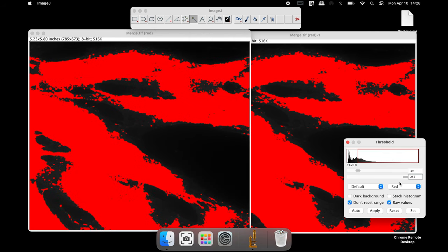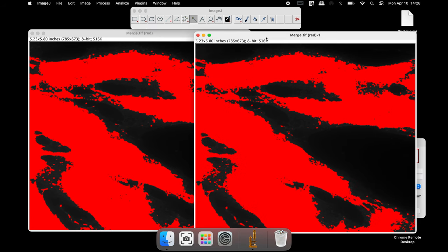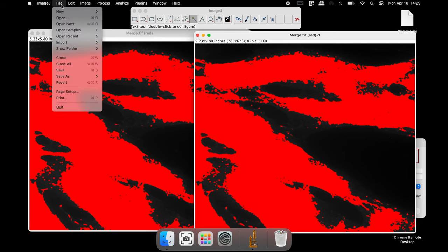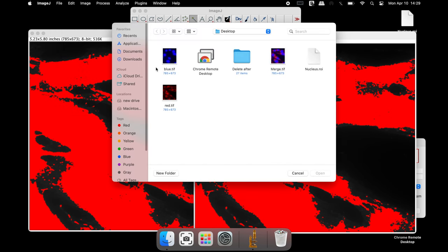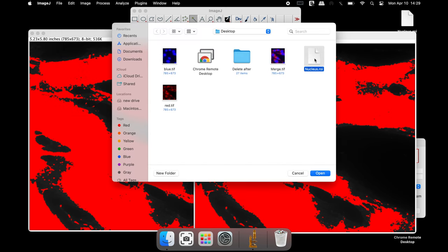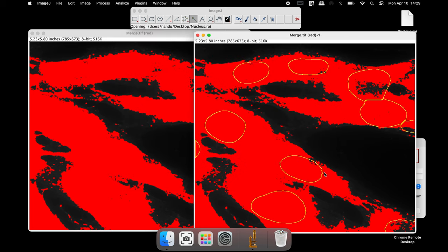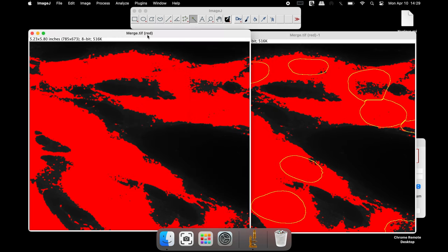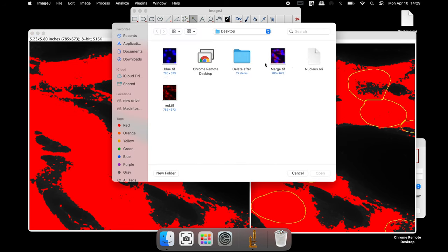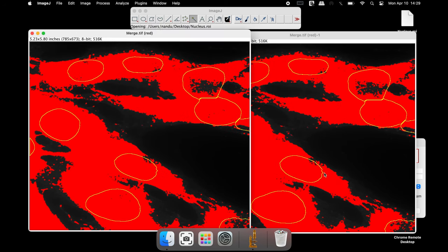Once the threshold is set, select the right hand side image and open the Nucleus.roi file that was saved earlier — now the nuclei are selected. Repeat the same step for the left hand side image.